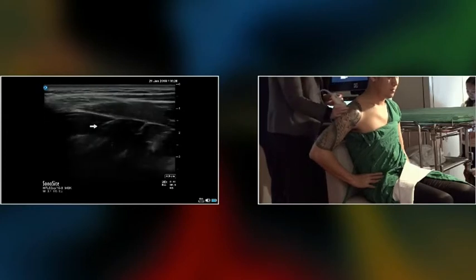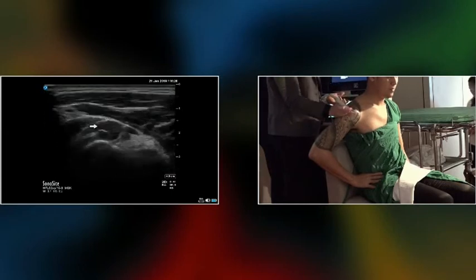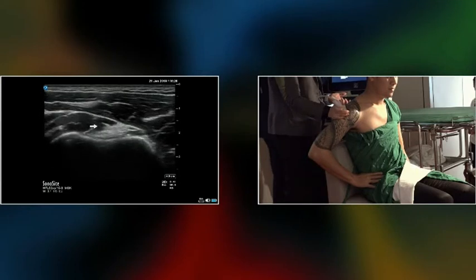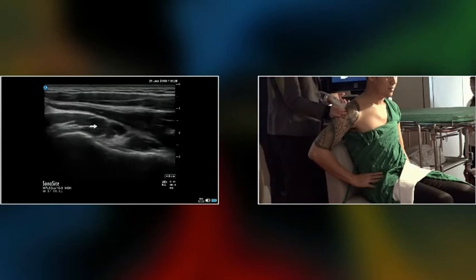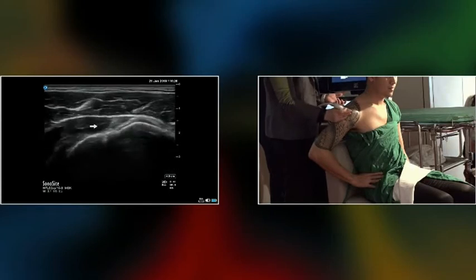So some people, if they have pain or have a good muscle bulk like him, you would like to scan like this, okay? From the end to a little bit posterior, and relax.